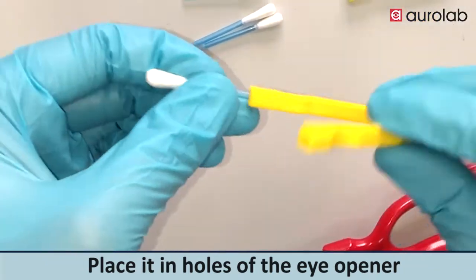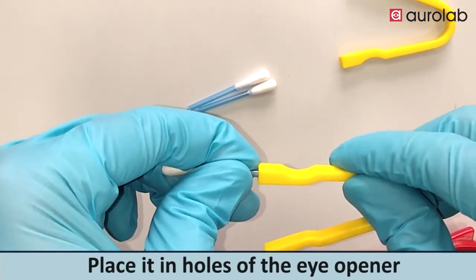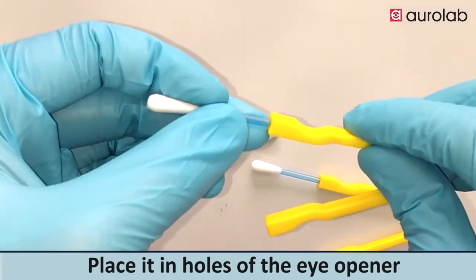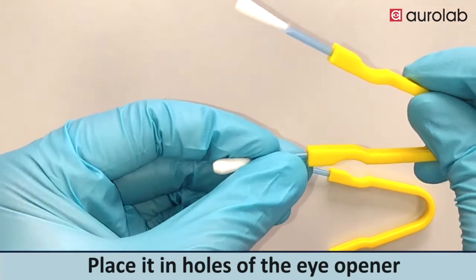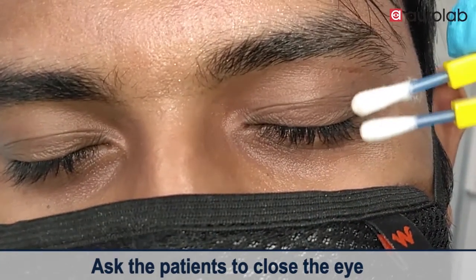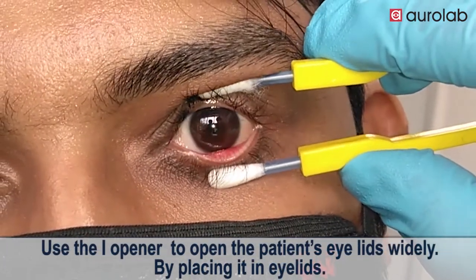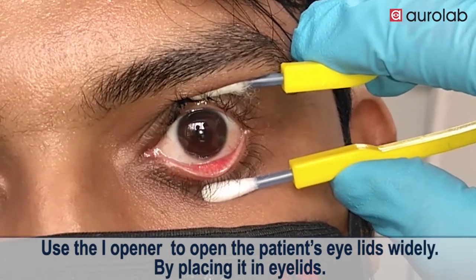Place it in the holes of the eye opener. Ask the patient to close the eye. Use the eye opener to open the patient's eyelids widely by placing it in the eyelids.